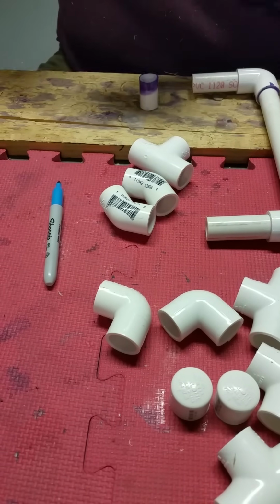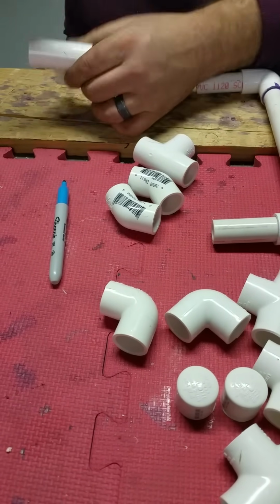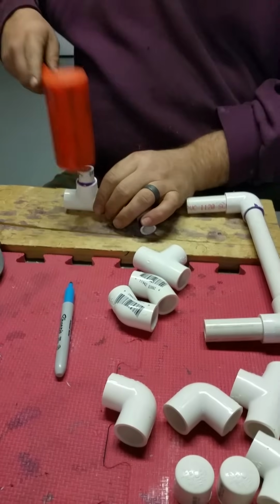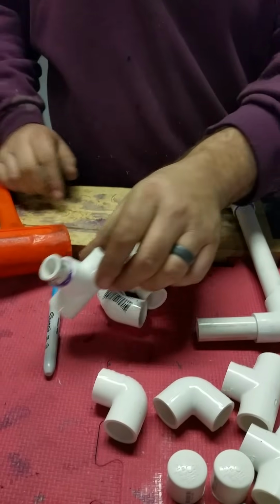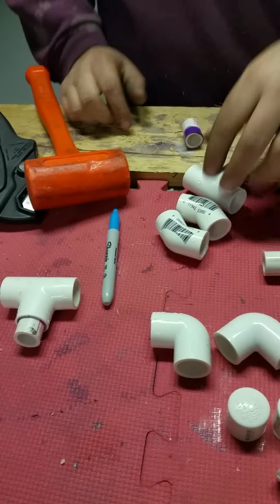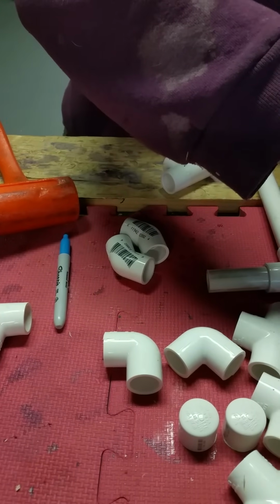Sometimes the pieces are a little bit stubborn to get in there because of the cut. So you just saw he looked inside to make sure that there was full engagement inside, that it couldn't go any farther. That's why the rubber mallet is very handy.